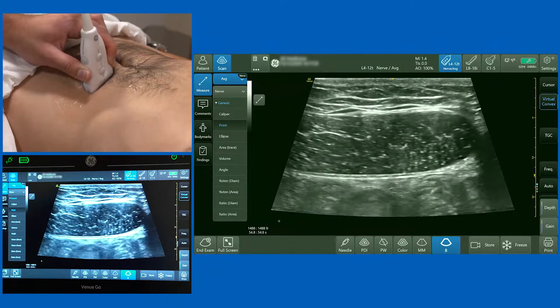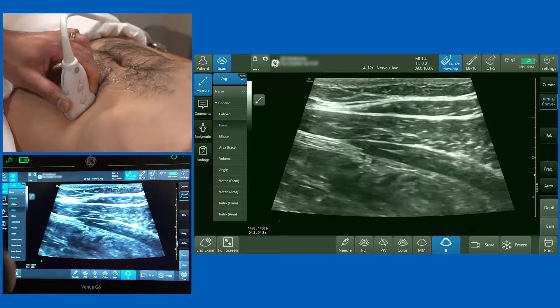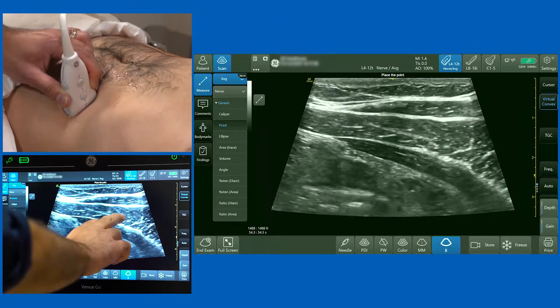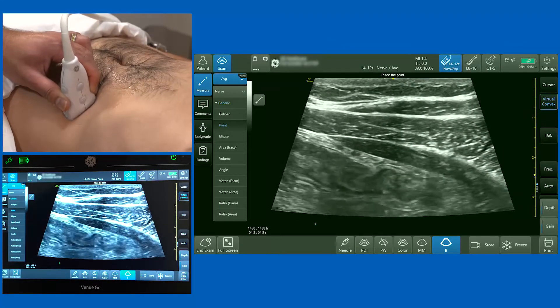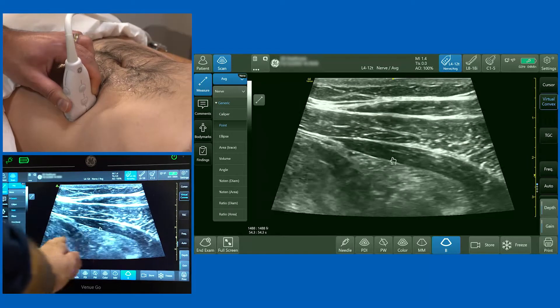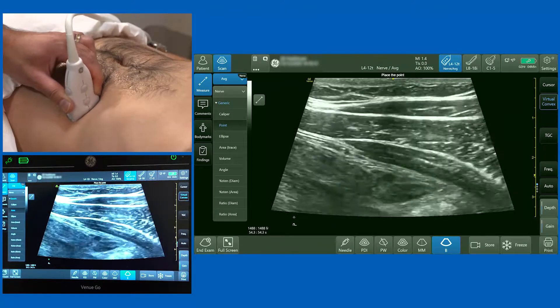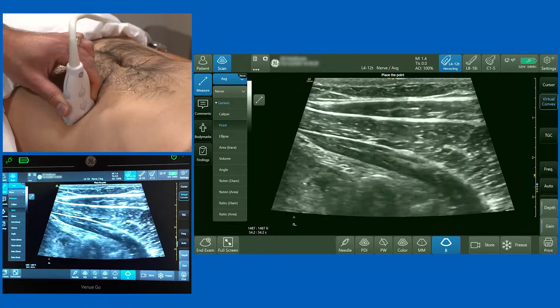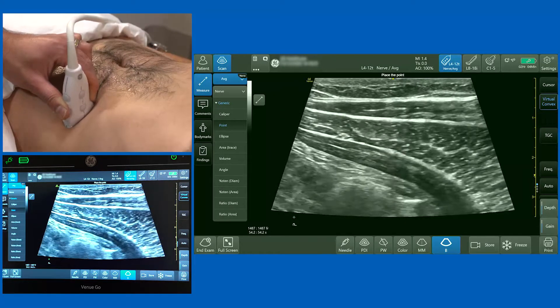The first thing I'm going to do is bring the probe way out laterally. As we do that, I want you to appreciate that we've got three muscles very clearly evident on the screen. Most superficially you've got the external oblique, then a very thick internal oblique, and then a much thinner transversus abdominis muscle. Deep to those muscles you can see the peritoneum and bowel content moving. More superficial to that is a very thin layer of adipose tissue. Identifying those three muscle layers is a useful way of orientating yourself, especially if your patient has a little more adipose tissue.